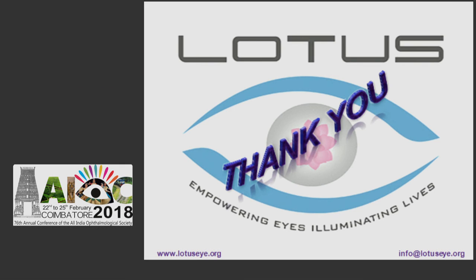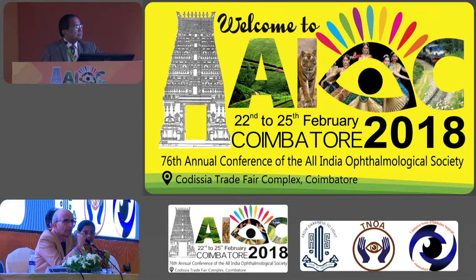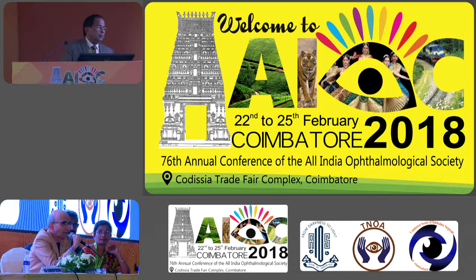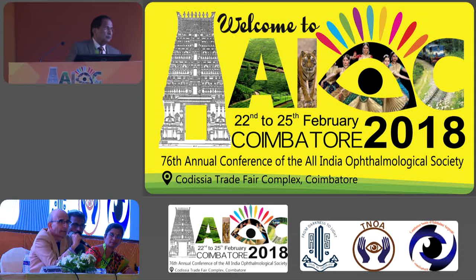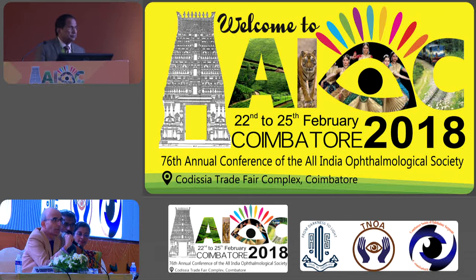Thank you. I think the key difference between what we have been doing and with the assistance of LensX and other similar machines is the predictability or consistency, as Dr. Ramamurthy and Dr. Sundarmurthy said. We did a study where I did 100 consecutive rhexes and I could do 99. My junior consultant could do 93 or 92, and my fellows with more than 1 year could do 82. So 100% of the time with this LensX, we can do it.